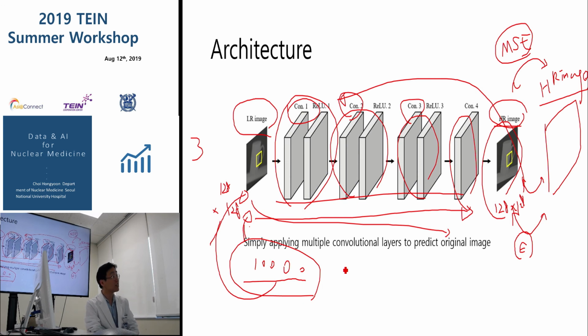So this model, you mean if we give low dose FDG uptake, we can get high resolution using this, even with low dose? Yeah, right. There are some 3 or 4 papers regarding low dose FDG PET to recover the high dose PET. For the training, they also use simulation data of the low dose PET.